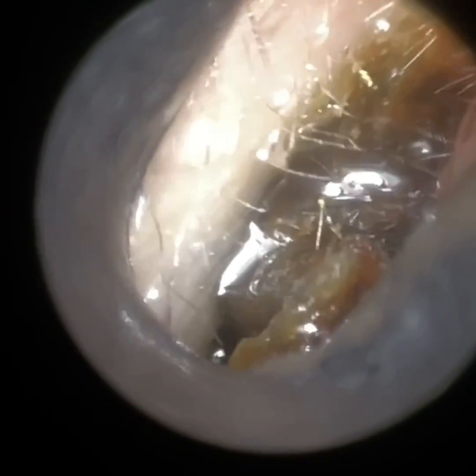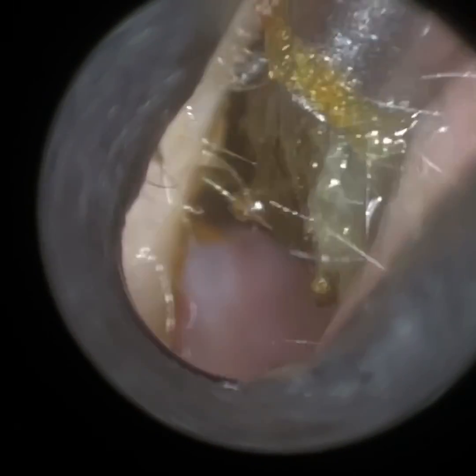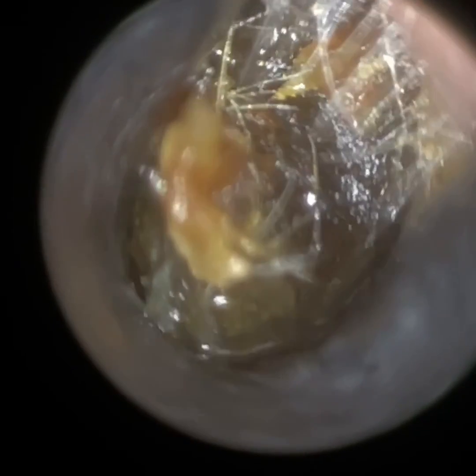That requires a high level of bilateral coordination and integration. With the Waxscope, the specular opens up the ear for you already — it's a bit like when you're already performing earwax removal using head loops or an ENT microscope. The specular's dynamics, shape, and architecture are similar to your standard Shea, Rosen, or Tamarkin specular. It has a flared tip, so it prevents you from over-inserting, and it just helps to widen the ear canal. So it's a lot more user-friendly.